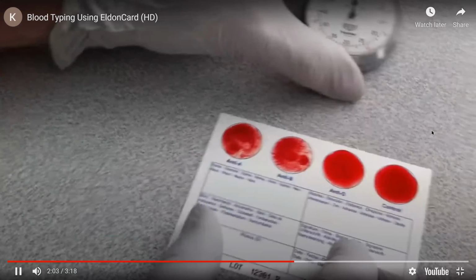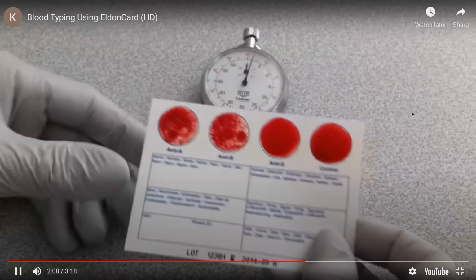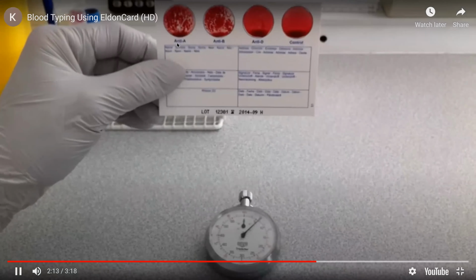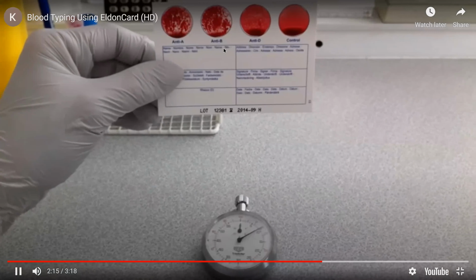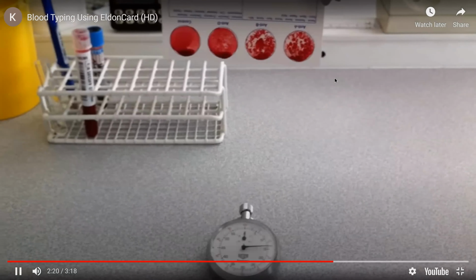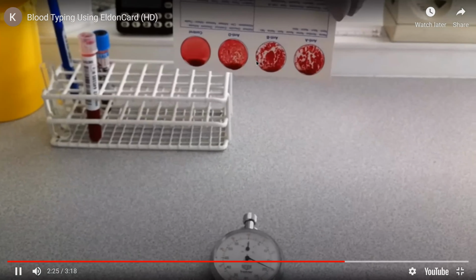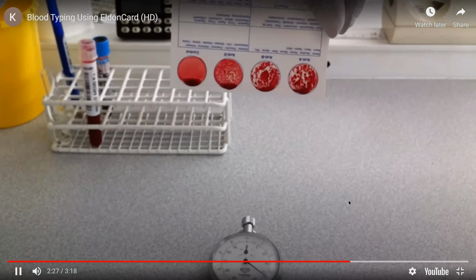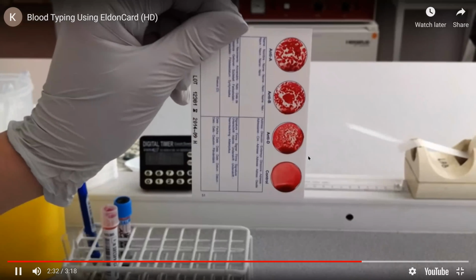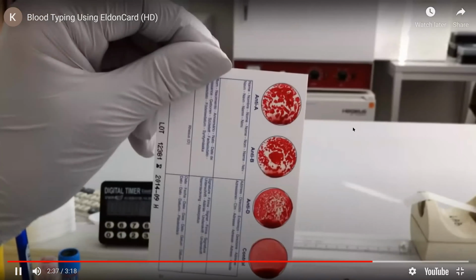So what you can see here already, even though they're setting a timer, is that there is definitely some agglutination going on. Anti-A and anti-B, those antibodies are definitely clumping onto the blood, which indicates that there are presence of those sugar tags in this blood type. Even anti-D is kind of clotting a little bit too. So I want you to think about what blood type this person would have, since all 3 of them are clotting up: anti-D, anti-B, and anti-A.